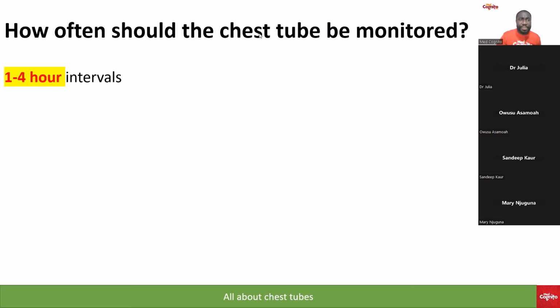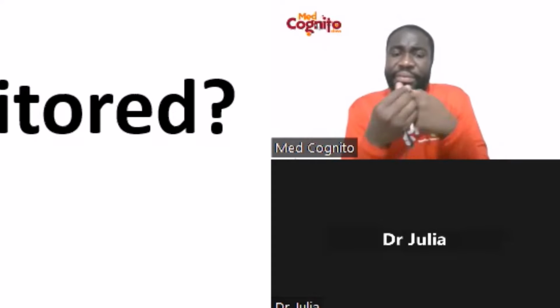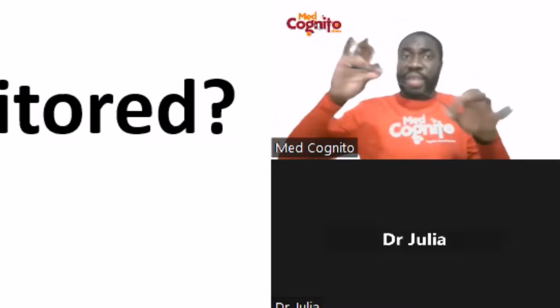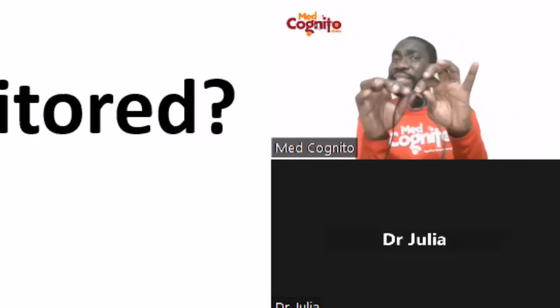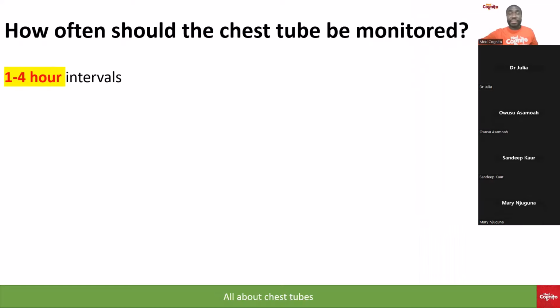What is kinking? Okay. Good. So kinking is basically, let me take this wire, for example. Please, can you see this wire frame? Good. It's like the way things can fold on themselves and kink. That's what you call kinking. It will just kink like that, right? Because the chest tube, it's a tube, right? So you want to avoid its folding on itself because it affects the pressure which you are trying to generate in the lung. That's negative pressure, basically.